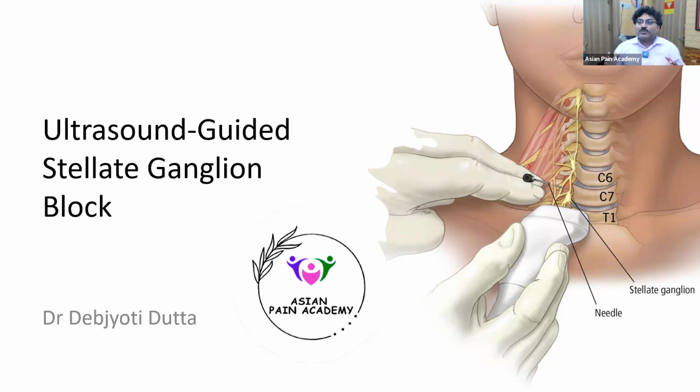But remember, fluoroscopy is a technique that is slightly better compared with the blind technique, but it doesn't show the vessel. Under fluoroscopy, the initial technique was the anteroposterior technique, which was not much different from our classic blind technique. Here also, from the anterior side, we used to hit the Chassaignac tubercle, but under fluoroscopic guidance. Then we inject dye to check whether we are inside the vessel, in the longus colli, or above the longus colli.